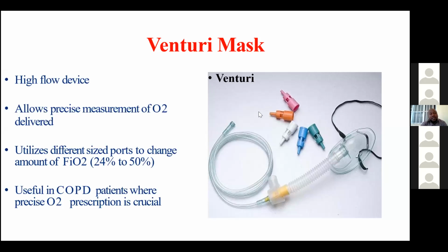You can also use this to deliver 24 to 50% FiO2 using fewer liters of oxygen. So you are not wasting oxygen, and you may have lower costs. We need it when we need to give more FiO2 with precise and constant oxygen. Next, please.